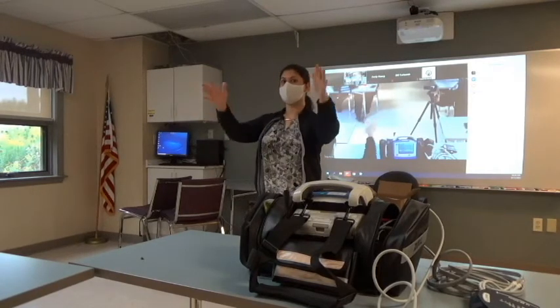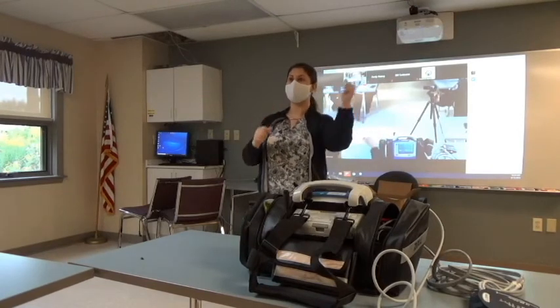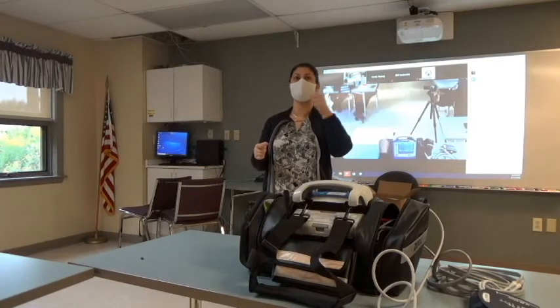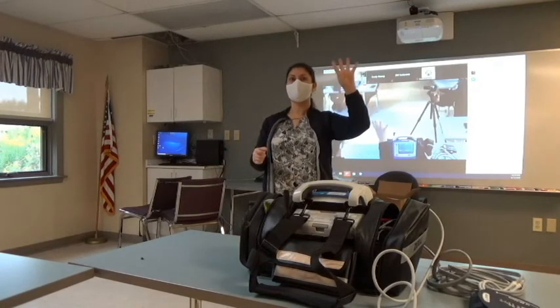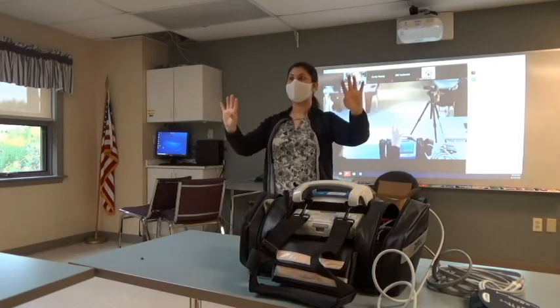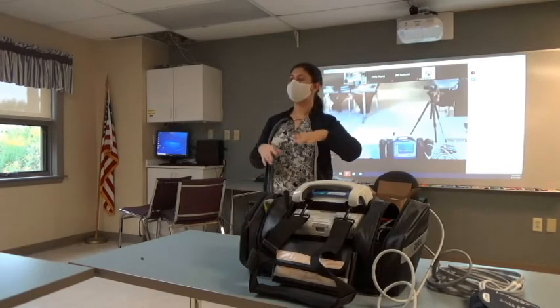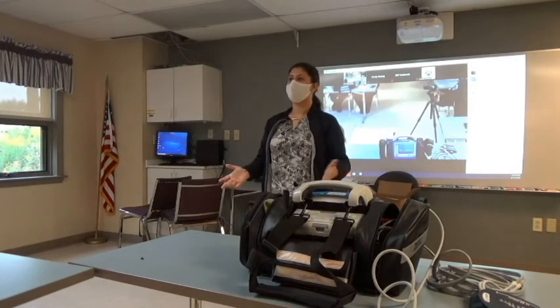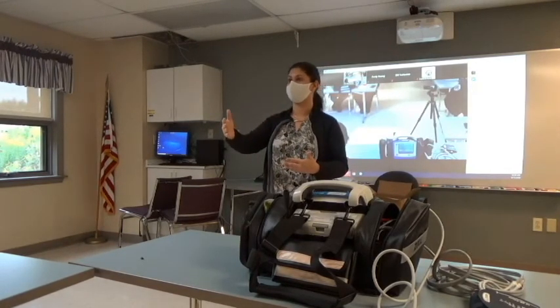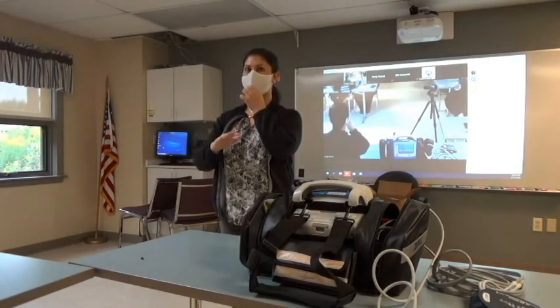So the question, just so we're all, and I'll get to everybody in just a second. One of the questions was, if the lead comes off, you can still see the picture because it's reading off the pads. No, not with pacing. With pacing, the four lead shows the picture, the pads deliver the energy in demand mode. If something catastrophic happens and you lose an electrode, it then says, you know what, I can't see the picture anymore, but I know the orders that you gave me. I'm going to keep marching so I don't lose capture for you. So it's going to read off of the pads and be in fixed mode as a safety net. Okay. Does that make sense to everybody? Yes. Yeah.